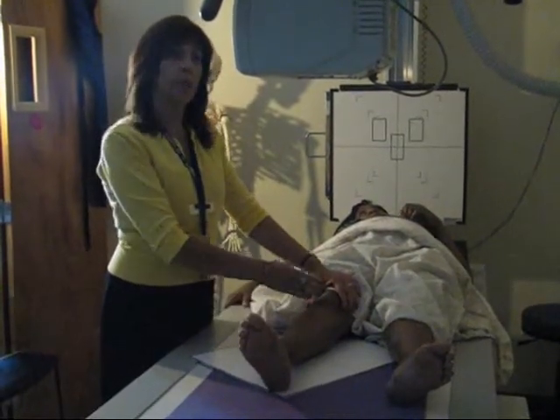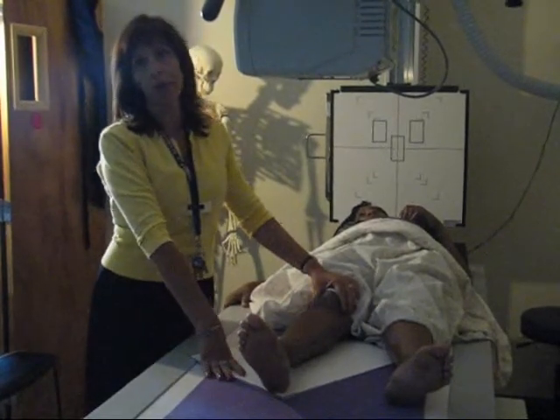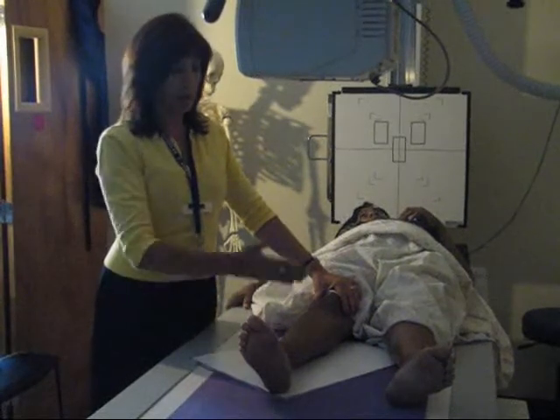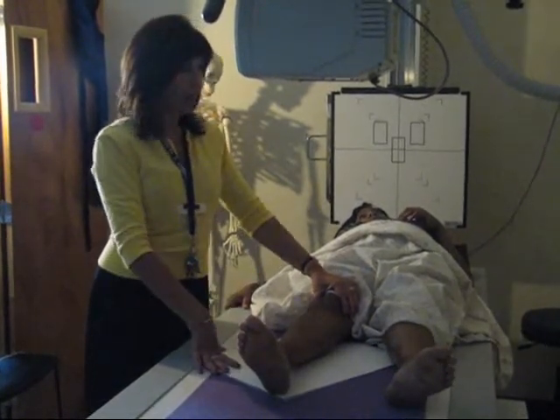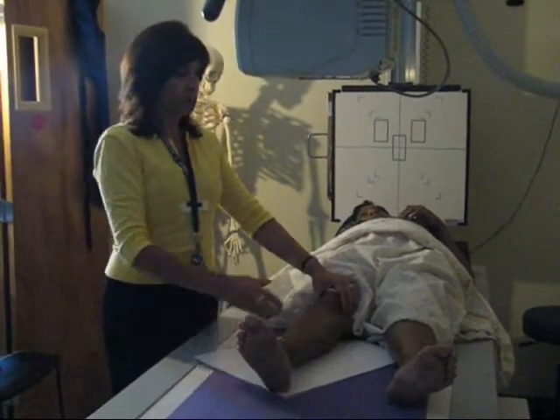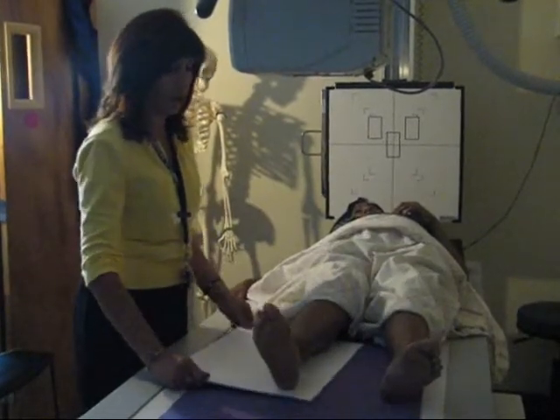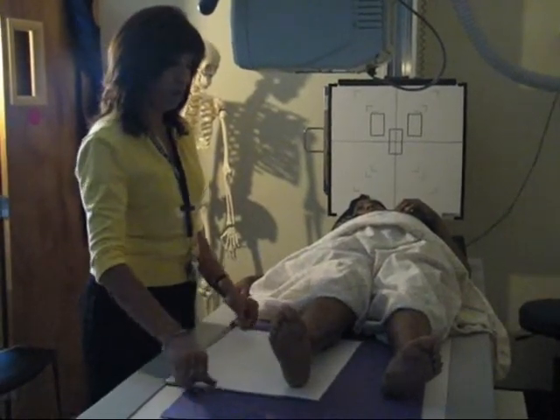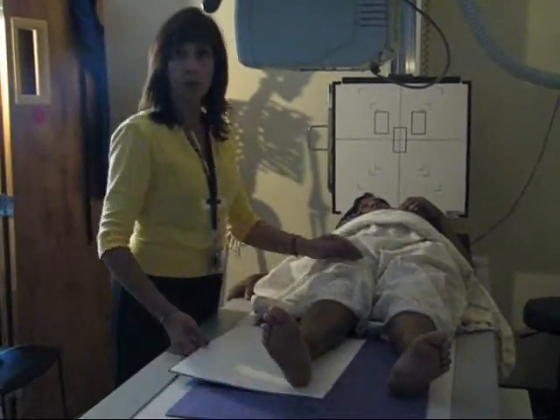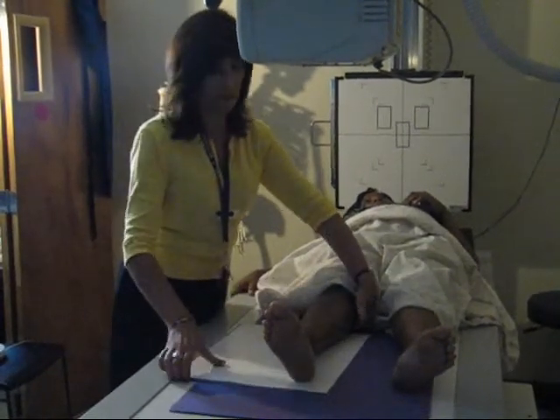In the case that the patient's leg is too big, and even using a catty corner cassette you're still cutting a part of interest, you can do two projections. You would do a projection where you would get the ankle, and then another projection where you would get the knee part, okay? But you never want to miss the part of interest.